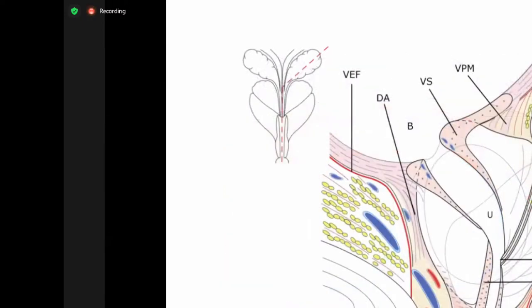And the second part, which is difficult, is about two areas. Number one is the bladder neck, and number two is the urinary sphincter. So this blue line is usually where we create the enucleation plane. Distally, the sphincter is very important. So we usually would try to divide up the sphincter part, the apical area, to release the sphincter, so as to maximize the urinary continence function afterwards.